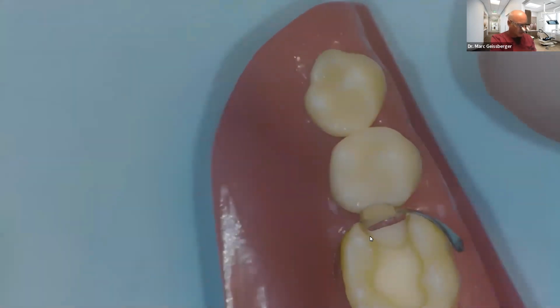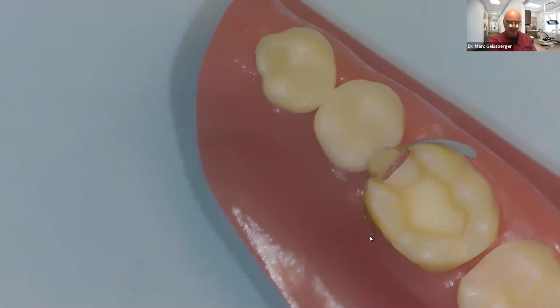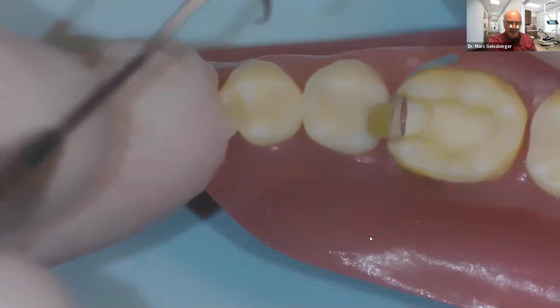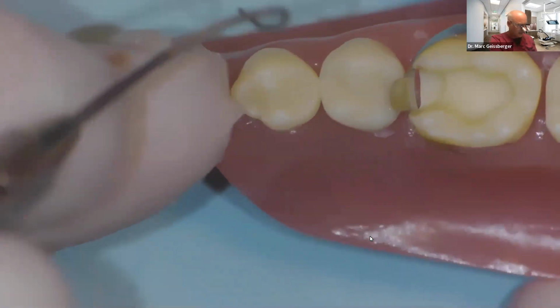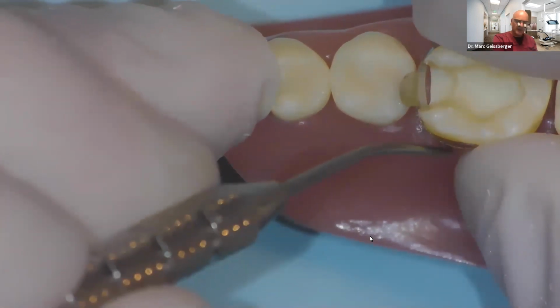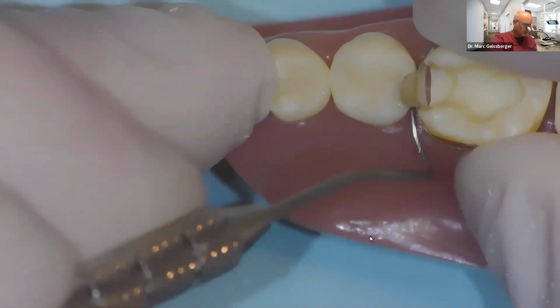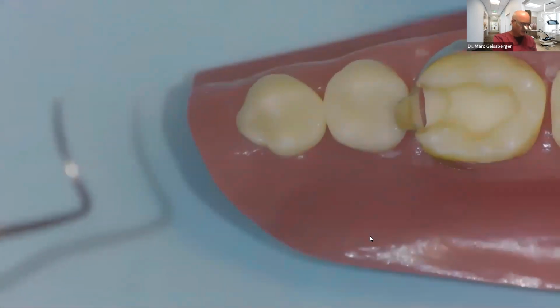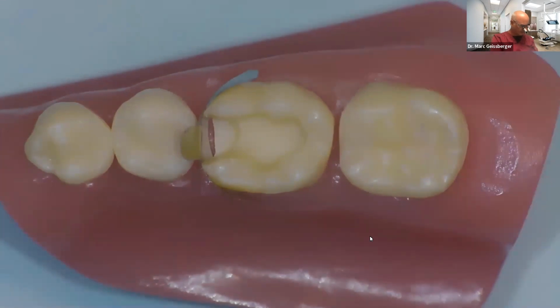I want the band at a height so that the curvature that is presented in these bands, and I'm going to point that out to you, there's a little curvature at the top of this band right here, and that curvature provides us our marginal ridge. Now, what you can see is cervically I'm open. So I'm going to come in here now with my wedge. I'm going to wedge this, and I'm going to compress that against the gingival aspect of this tooth.